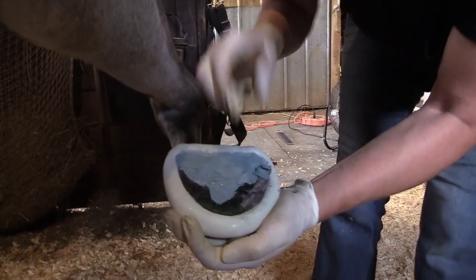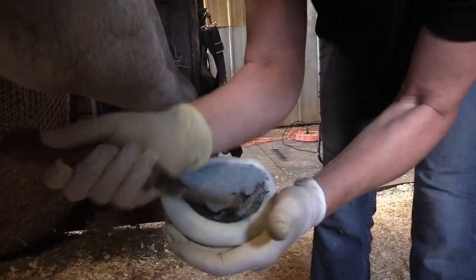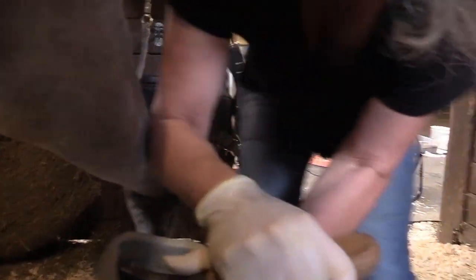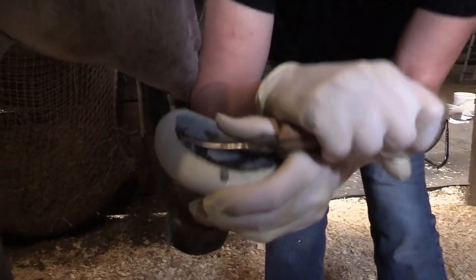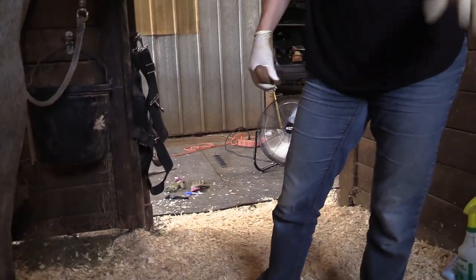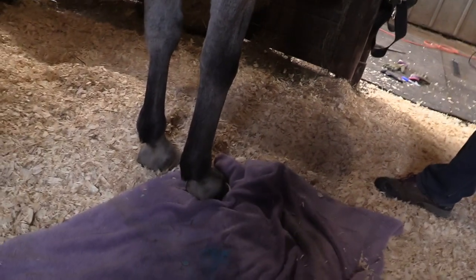Whoops. She eating? Yeah, I'm liking this. She's licking and chewing. She's not eating. I'm able to take a little layer of sole off. It still looks okay. Yeah. Sole.